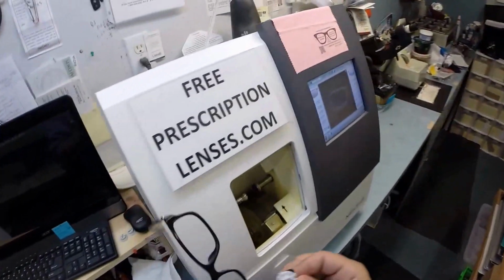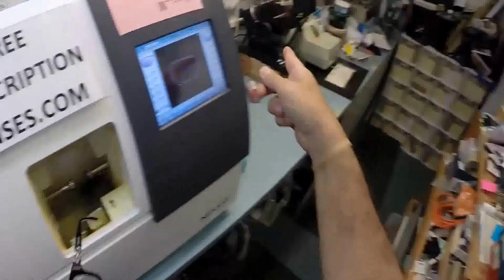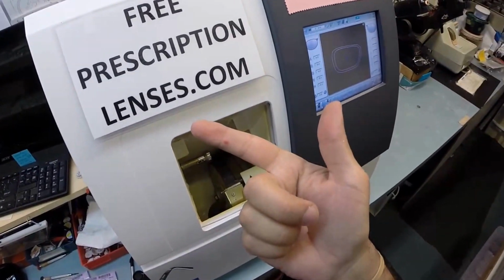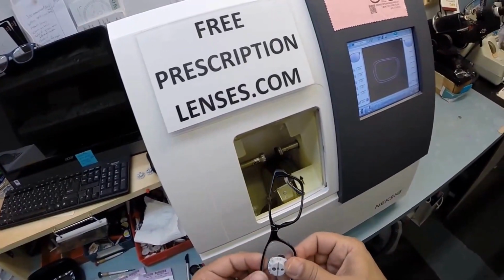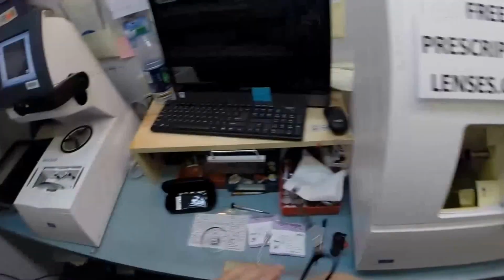So, I'm going to take the lens, I'm going to tuck it into the outside, and don't worry, that's not blood, that's ink from the lensometer. If this were blood, I would be crying now. That's how you can tell the difference. But I tuck it in at the outside corner, then using my thumbs, I snap it in. It fits in there perfectly.